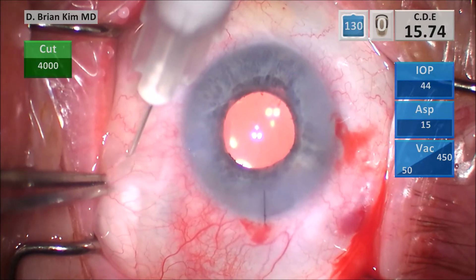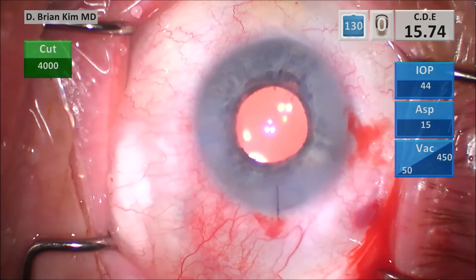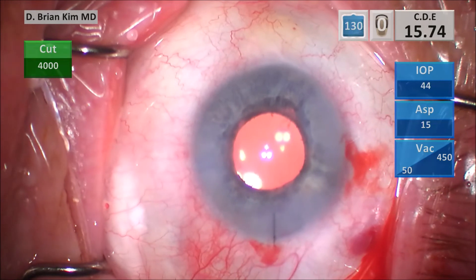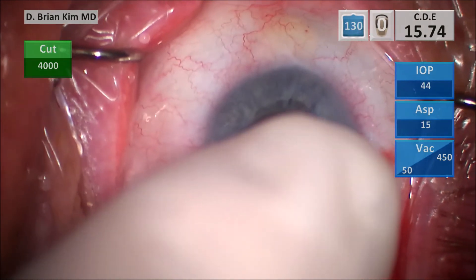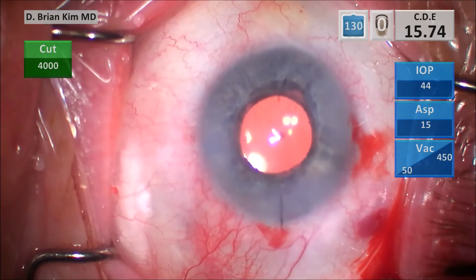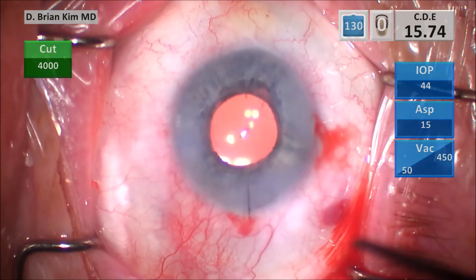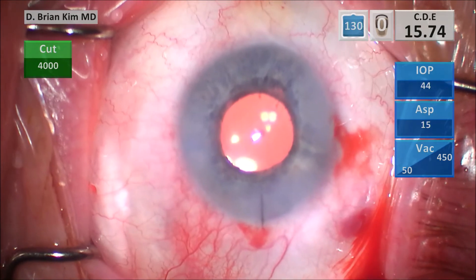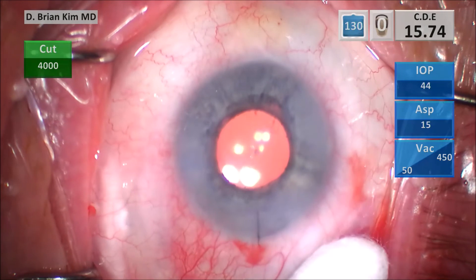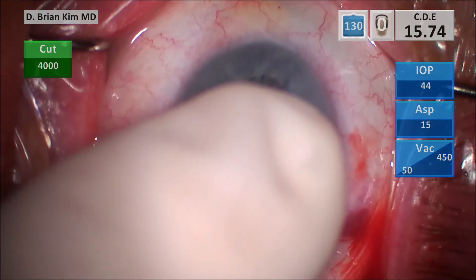I protected the posterior capsule with the chopper, and before coming out with the phaco tip I pushed more viscoelastic to fill the anterior chamber, then placed that lens into the ciliary sulcus as a three-piece lens and optic-captured the optic in a buttonhole configuration. My one mistake was keeping high infusion pressure — I could have reduced it to around 30 mmHg instead of ~60, which would have reduced the pressure head, not hydrated the vitreous as much, and prevented the chamber from shallowing. When I found vitreous at the wound, I placed the Weck-cel right over the incision — don't yank it away, just let it grip the vitreous and trim, so you're not putting traction on the vitreous base. I then placed a 10-0 nylon suture on the main incision, inflated the eye, placed the trocar, and did the pars plana vitrectomy — immediately the chamber deepened beautifully.